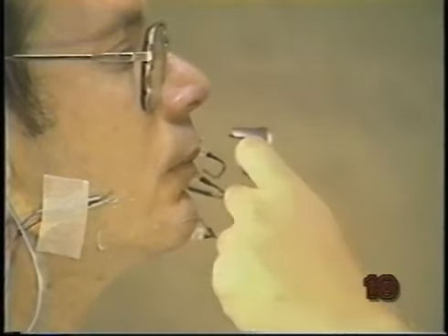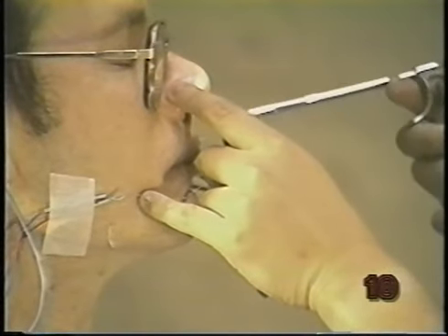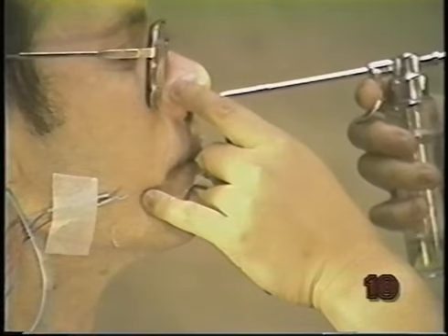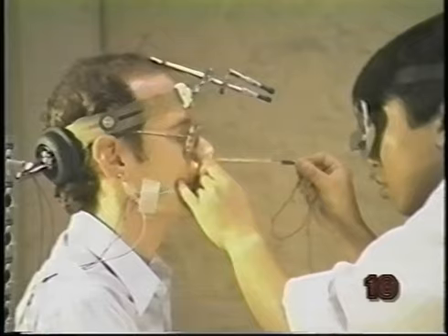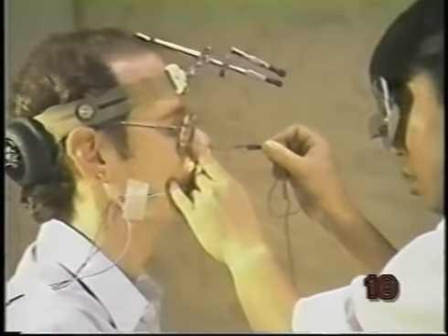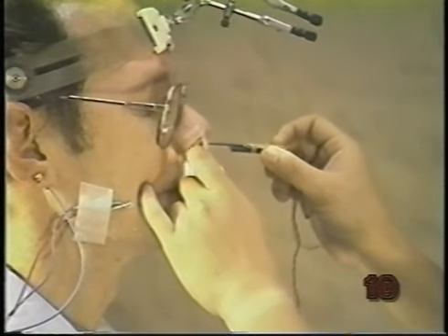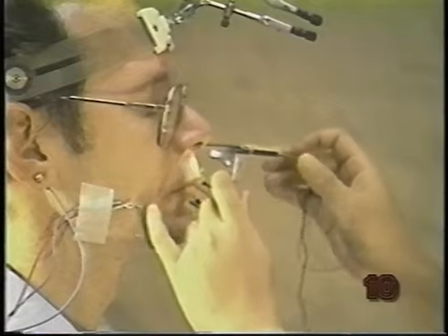Before inserting the velotrace, topical anesthetic and decongestants are applied to the nasal mucosa. The velotrace is then inserted using a procedure similar to that used for nasal catheterization. And although it's a rigid device, the insertion is easy unless the subject has serious nasal pathologies or deformities.